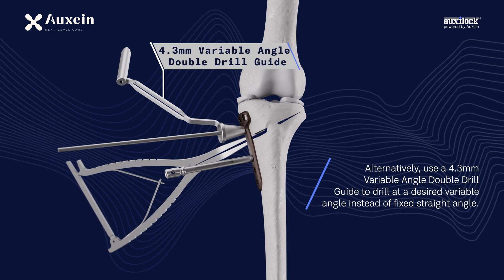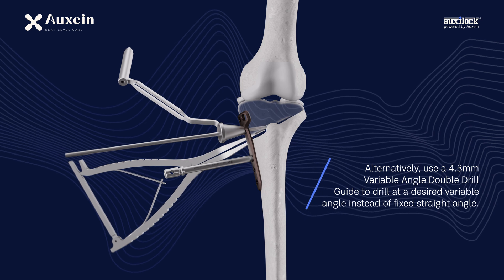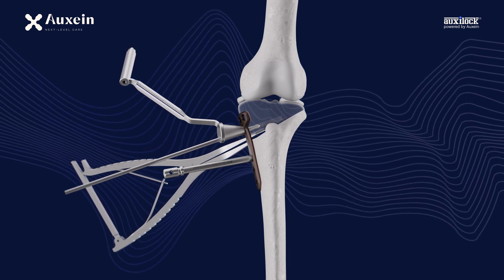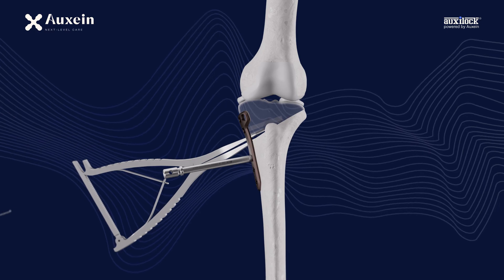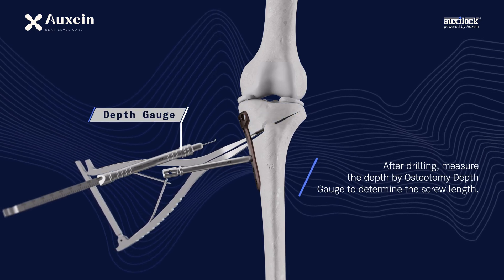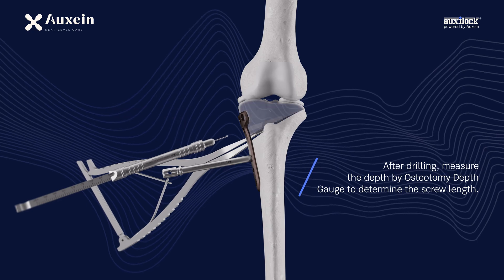Alternatively, use a 4.3 mm variable angle double drill guide to drill at a desired variable angle instead of a fixed straight angle. After drilling, measure the depth using the osteotomy depth gauge to determine the screw length.